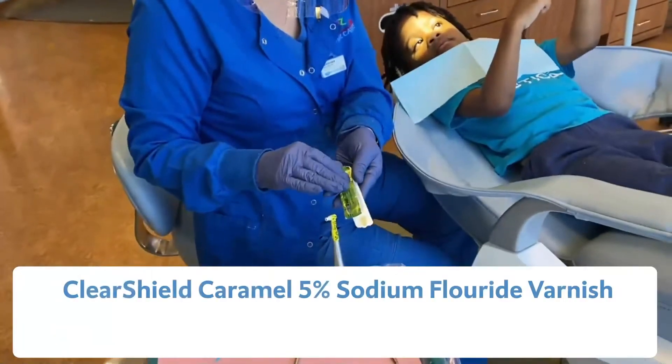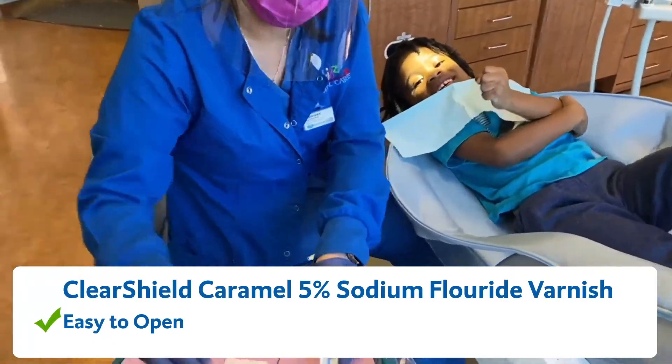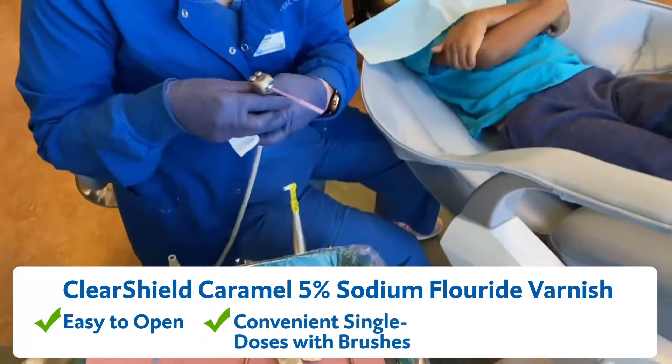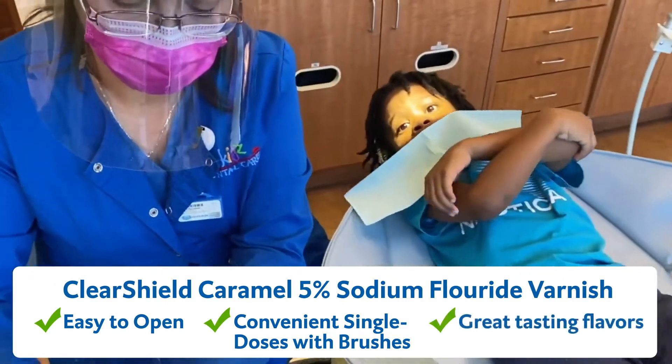Very easy to open the fluoride varnish — perfect, it has a little brush in it. We're gonna dry Kai's teeth.